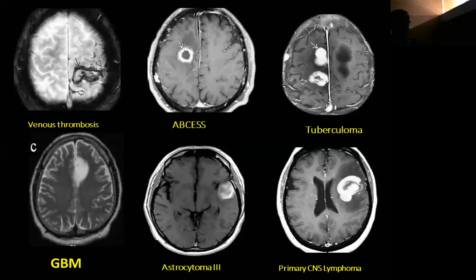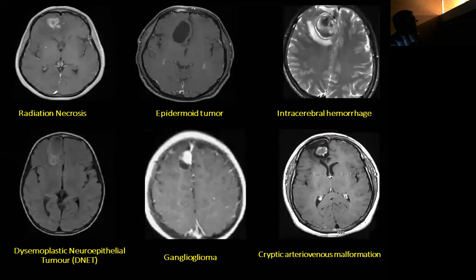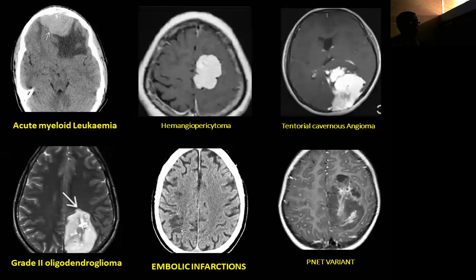Glioblastoma multiforme, parasagittal with dural base and enhancement. So different kinds of tumors. And the most important one is multiple sclerosis. There's so-called tumefactive multiple sclerosis. It looks like a tumor, like this. So you have to be careful about that. Radiation necrosis: after surgery, you give radiation and you don't know whether this is tumor or radiation necrosis. Hematomas, various types of pathologies there. Myeloid leukemia, meningioma, you name it.